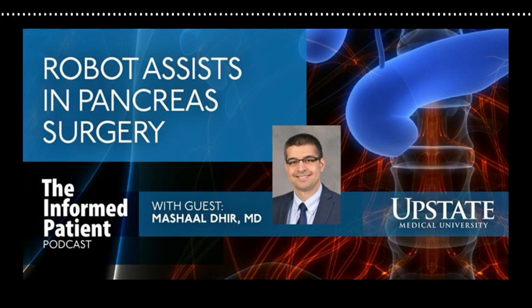Which patients would be candidate for the robotic procedure? The patients have to have smaller tumors, away from the blood vessels, because when we're working on the blood vessels, it's good to be there with your hands in terms of controlling the blood supply as there's potential for bleeding. So smaller tumors around the junction of the bile duct and the pancreatic duct are good for the robotic procedures, tumors which are away from blood vessels. So that's where we are offering robotic surgery in our practice.